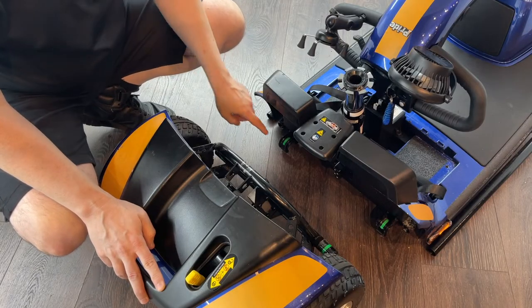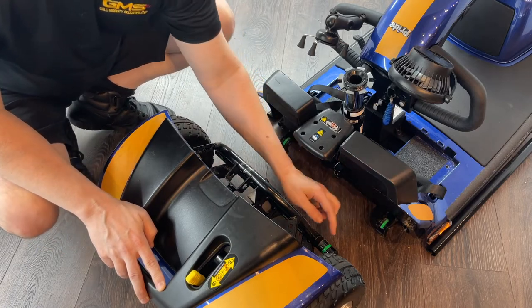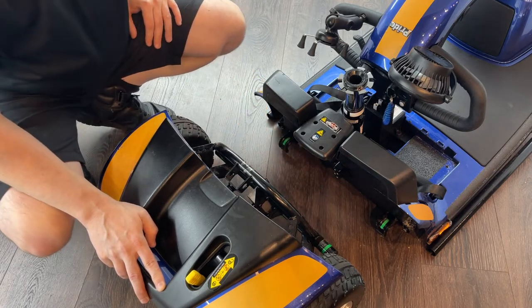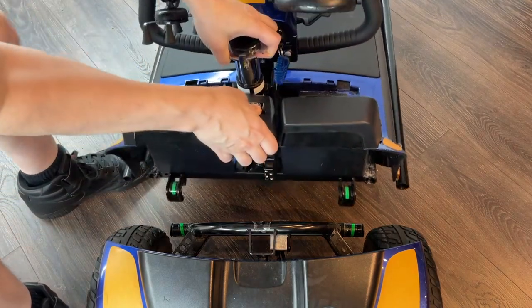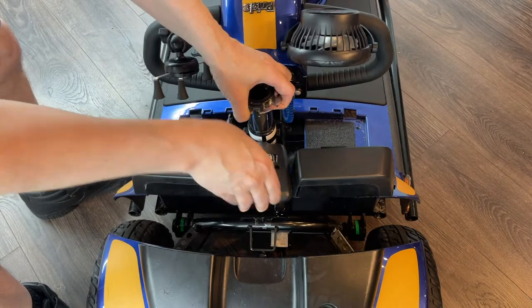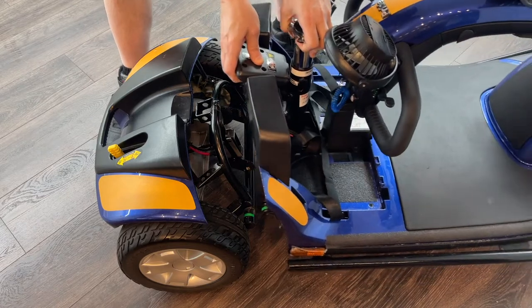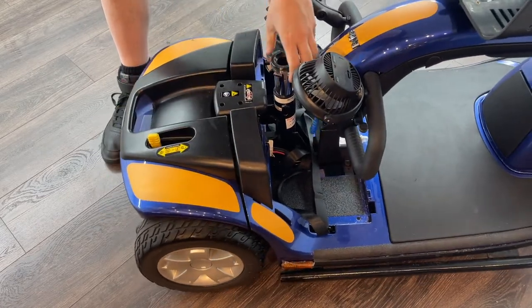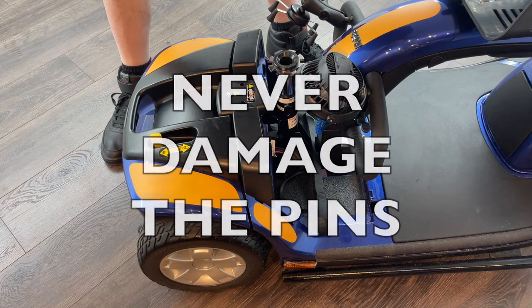Step one: align the two hooks with the rear drive unit and gently let the halves come together. The scooter is designed to snap in place — do not force it closed. Lift the body by the seat post, never the plastic, and latch it into place. Always make sure not to damage the pins, or you will be stuck.